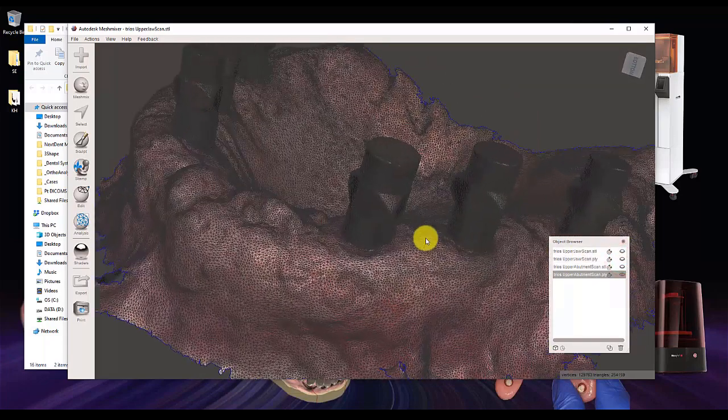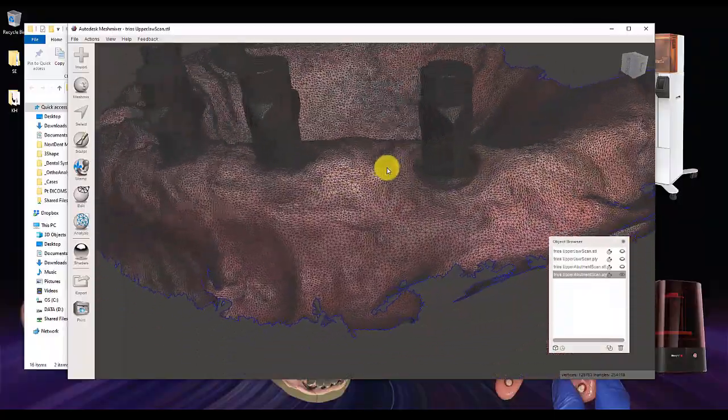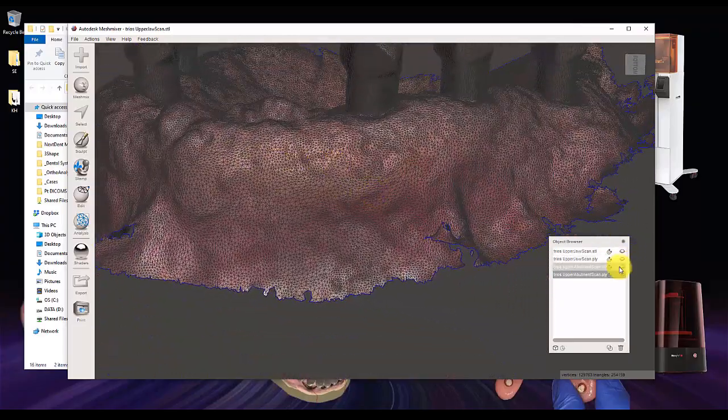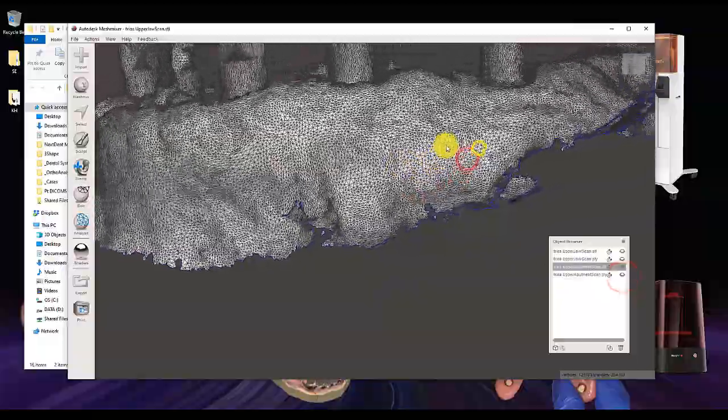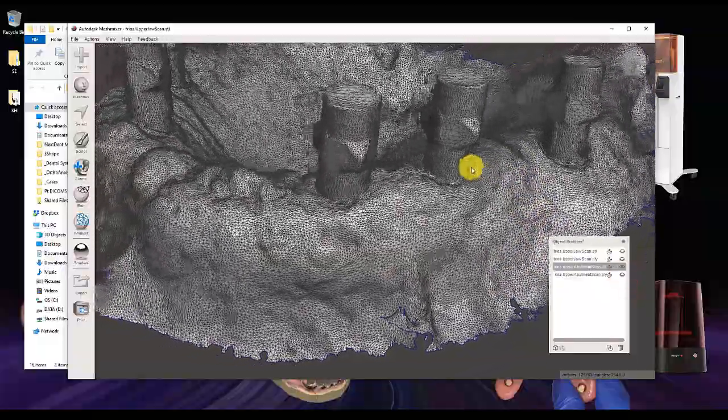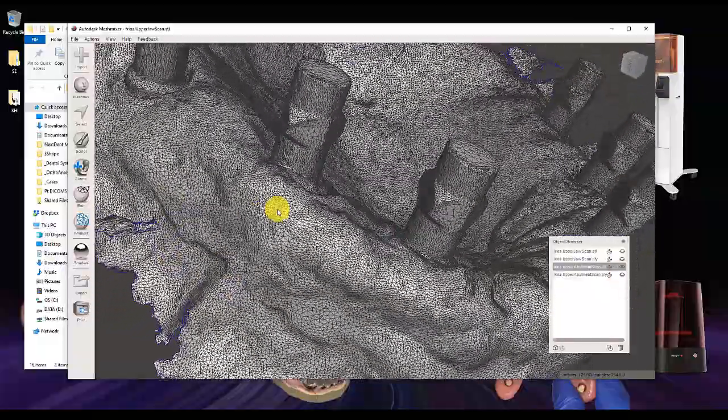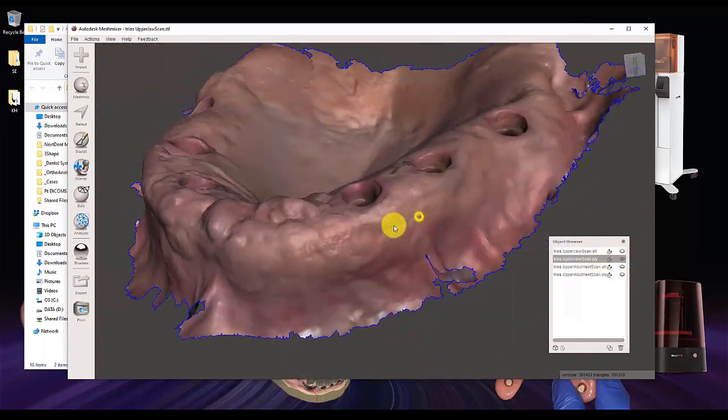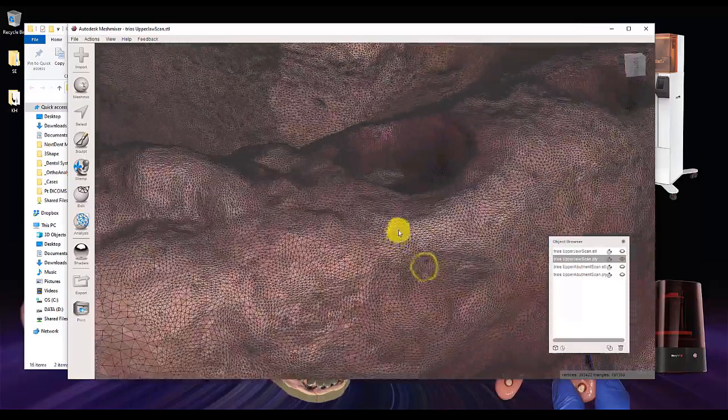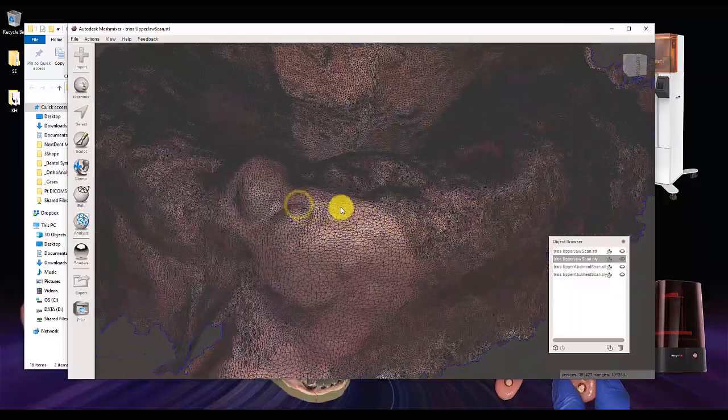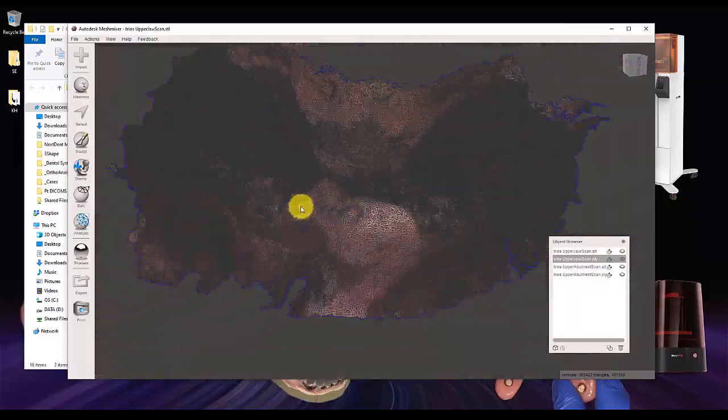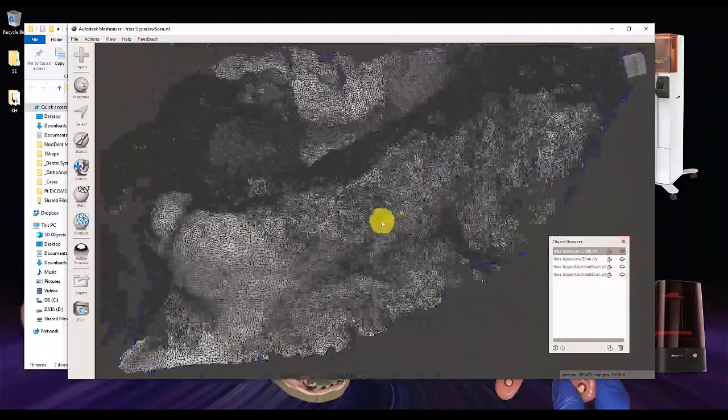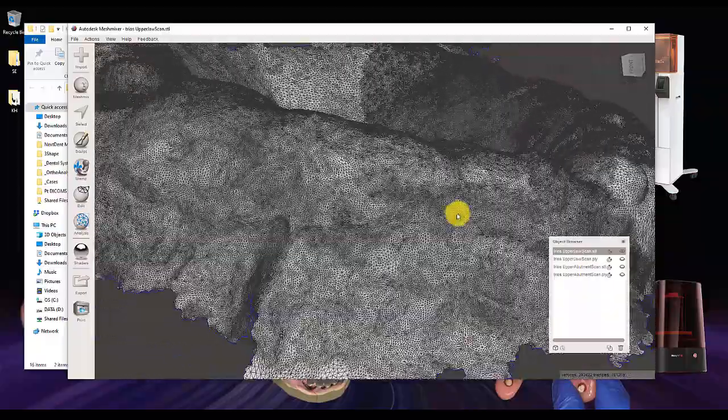So let's go ahead and turn on the wireframe mode here in MeshMixer. You can see here, this is what the mesh density looks like in the PLY file format, and here it is in the STL file format. Let's go ahead and take a look at it in our jaw scan. Here is our jaw scan. So our jaw scan has very, very tight mesh density around where we defined our abutments. And comparing that also with our STL. Identical.